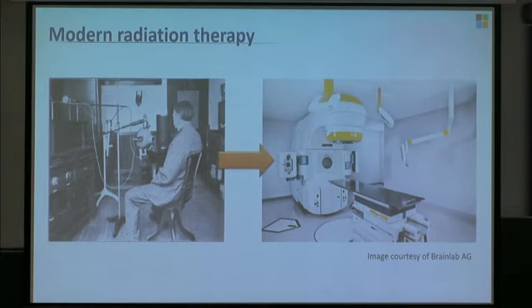This is the Brainlab Novalis radiosurgery system. It is a robotic radiosurgery device that has active patient monitoring. It uses three-dimensional stereoscopic imaging to monitor the external patient contour 60 times per second. It uses state-of-the-art imaging and radiation delivery to treat targets with sub-millimeter accuracy. And it will also use X-ray imaging and CT imaging in combination in order to ensure that we have the highest level of precision. Okay, so we have nice tools available to us now.